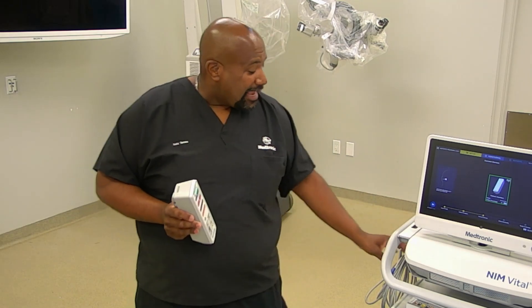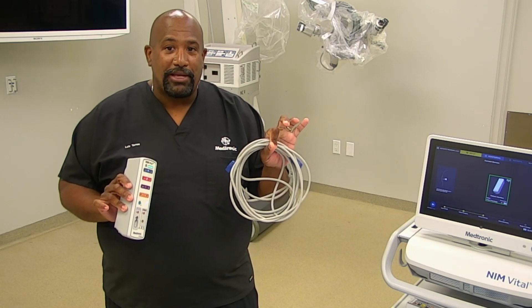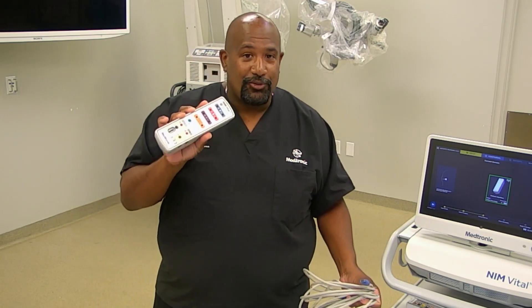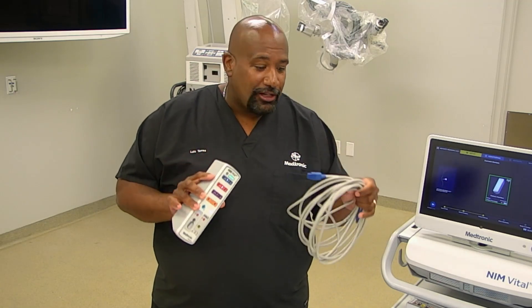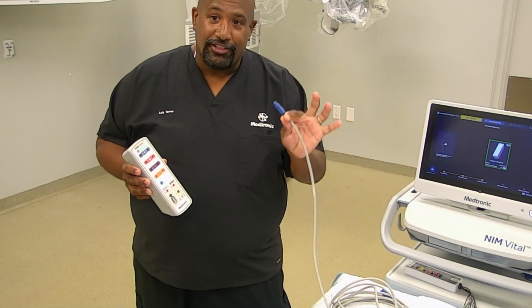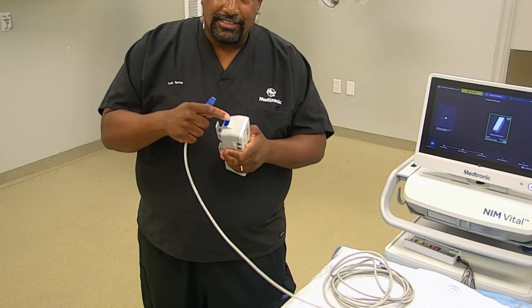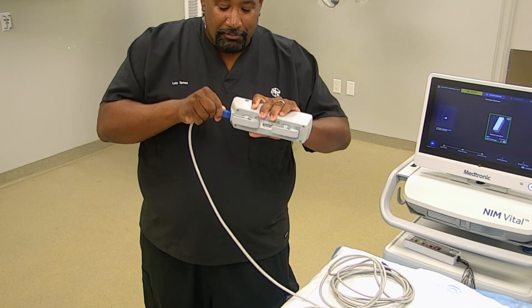There is a cable called your patient interface cable which you can quickly connect to the patient interface. The battery normally lasts up to 8 hours, but if the battery is low you can use the patient interface cable. It has a blue connection at each end — both ends are the same. The bottom of the patient interface has a little blue section where you plug in the cable, so one end gets plugged into the back of it.